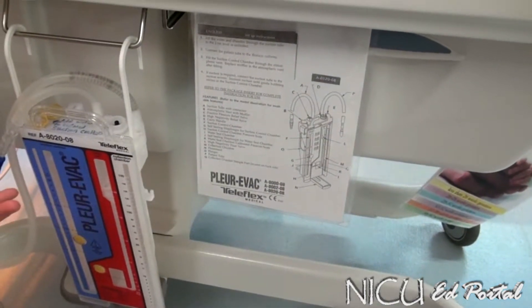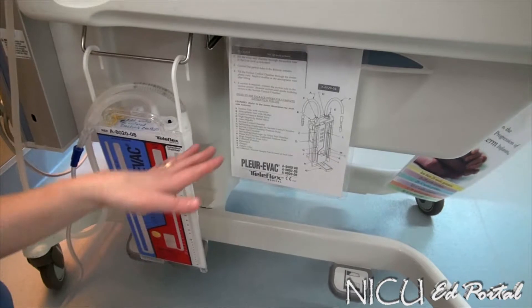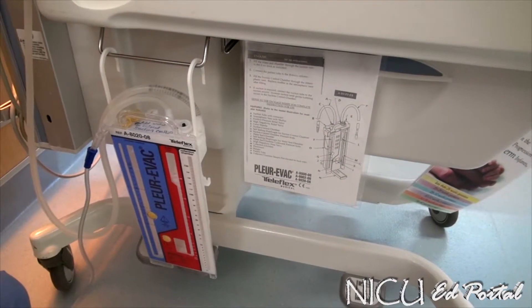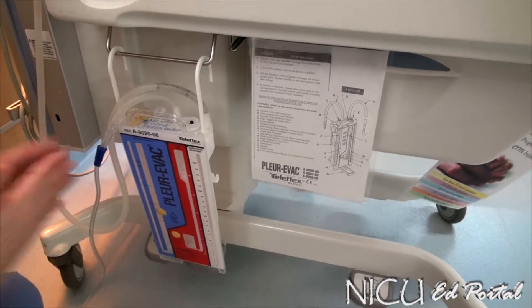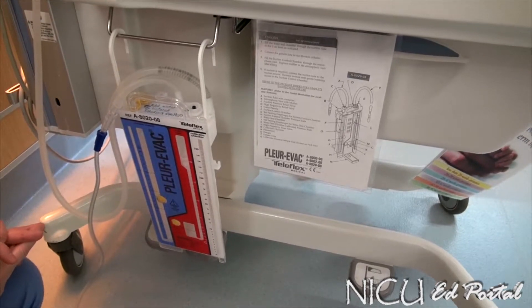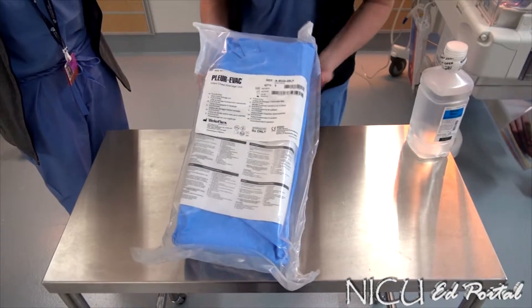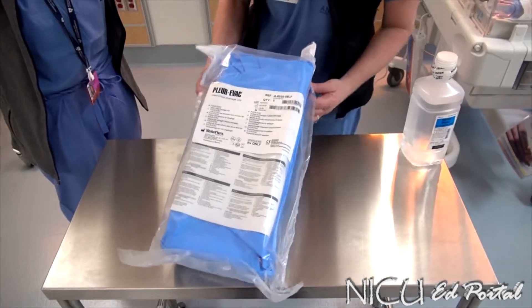With the unit, there's an insert that tells you what each part is, and that is within the unit package when you open it. For today's purposes, we'd like to clarify what each chamber does and what the parts to the Pleur-evac system are. So that's what it looks like set up. For next steps, we'll go to actually walking through setting up the package.